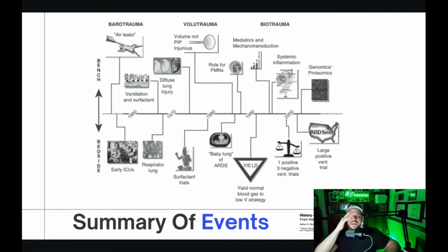There was a study that ventilated patients with higher pressures and lower pressures and different tidal volumes, and 0 PEEP, 5 of PEEP and 10 of PEEP. What really injured the lung was 0 PEEP with high tidal volumes, or really high peak airway pressures with really high tidal volumes and really high PEEP, which essentially just increases your alveolar pressure.